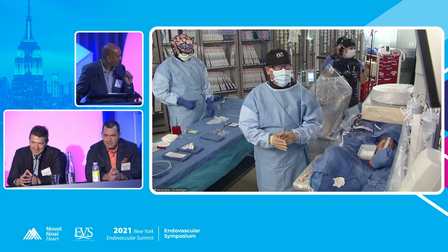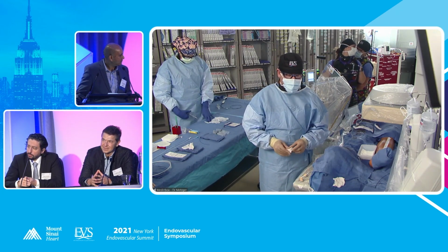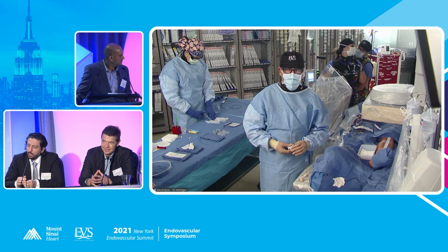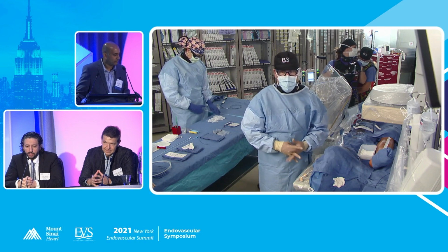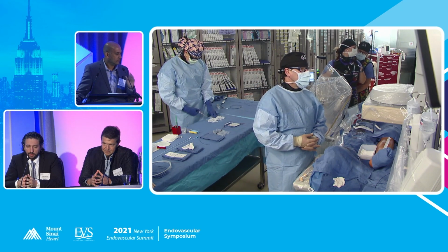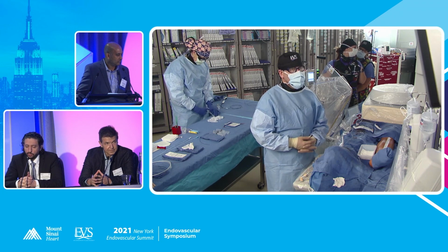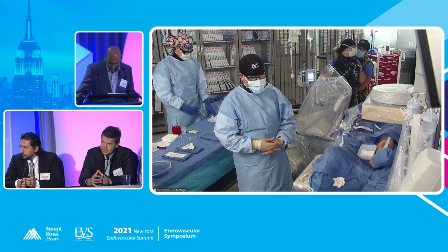Fadi, what do you think? It looks great, Chris. I would actually say that I would avoid stenting in that distal PT and around the ankle. I mean, we've seen disasters happen. It looks nice like the first couple of days, and then you have to deal with the consequences. So this looks great, Chris. Yeah. Thanks, Fadi. Just one quick question, Chris.